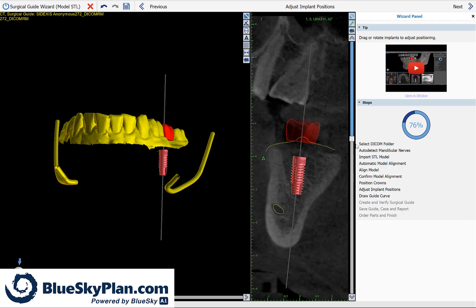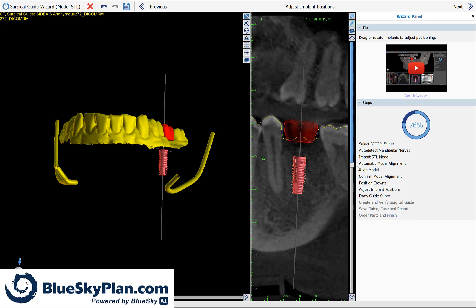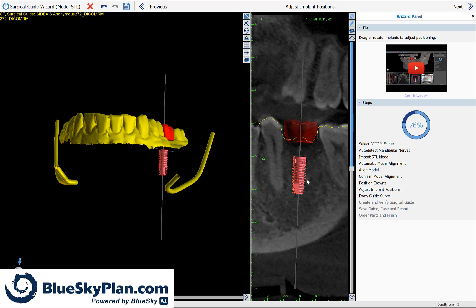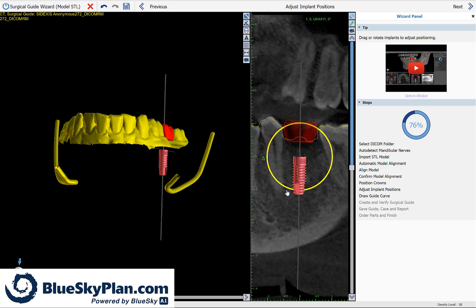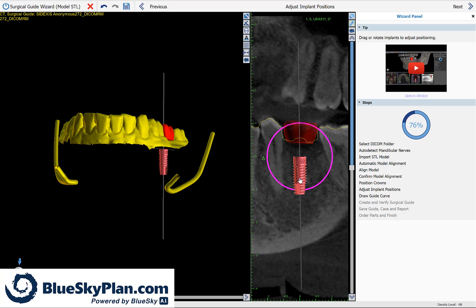If we need to fine-tune the placement of the implant, simply hover over, grab the circle widget, and rotate in the relevant direction. You can also move the implant by just grabbing the implant and moving it.